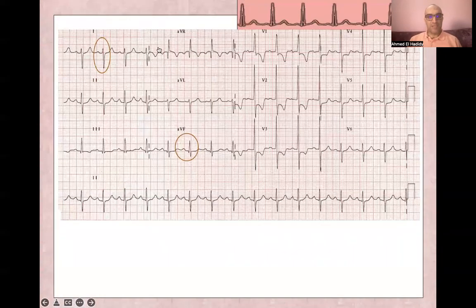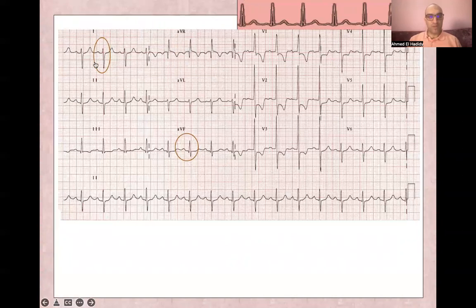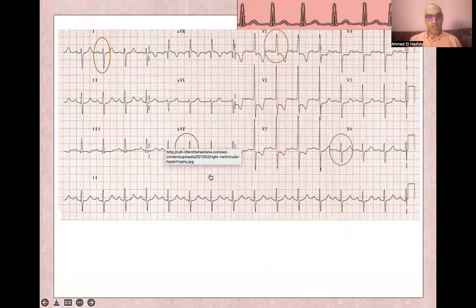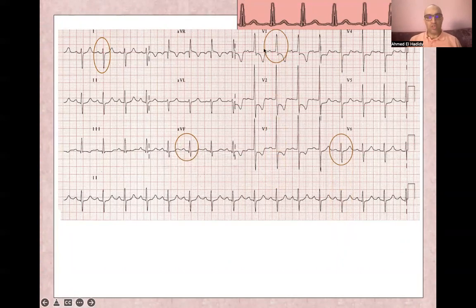Again, on an ECG for right ventricular hypertrophy, you will find right axis deviation, and you will find tall or dominant R wave in V1, and dominant S wave in V6.